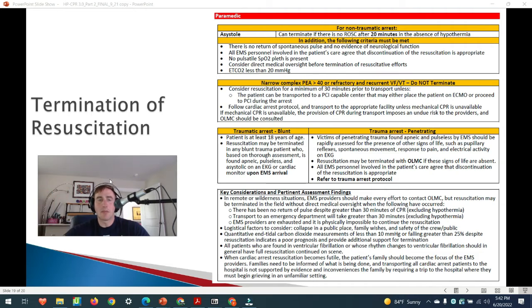I was called to back up a crew because they said, we've worked this patient for a while. They've got a beautiful PEA at a rate of 1-something. This patient has to have a pulse, and we really don't want to take them to JCEMS. So I got there. They had the SpO2 probe on, but it was not on the monitoring window. Switched it to the monitoring window. Paused CPR, saw a beautiful pleth. And I'm like, the patient's got a pulse. Let's find one. And sure enough, we found one.